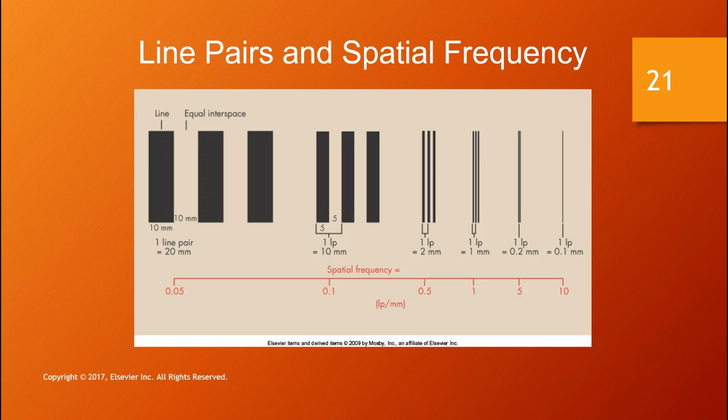That represents the line pairs per millimeter reading. Most humans are limited to 5 line pairs per millimeter. At the level where each line is 0.1 millimeter wide, a structure of this size supposedly could be easily discerned by the human eye.